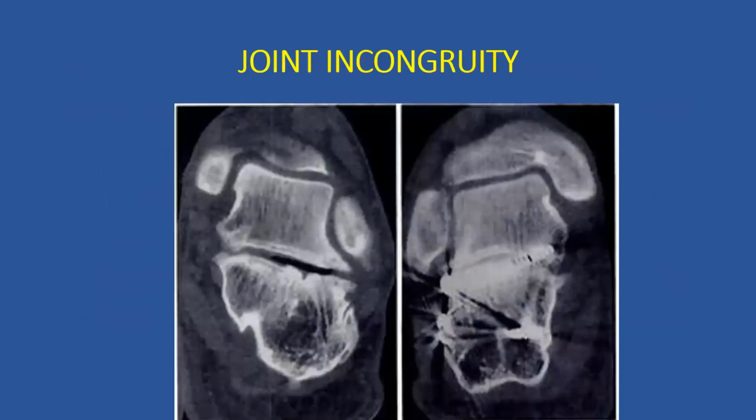In addition, what does CT help us with? It helps us in degenerative arthrosis, subtalar arthrosis. It will tell us about subtalar fractures, fractures of the calcaneum, fractures of the talus. It gives us an accurate measurement. And if we have a fracture of the tibial plafond, young fellows, one of the very first things we should do is ask for a CT scan to describe the fracture further, to help us in our operative planning.